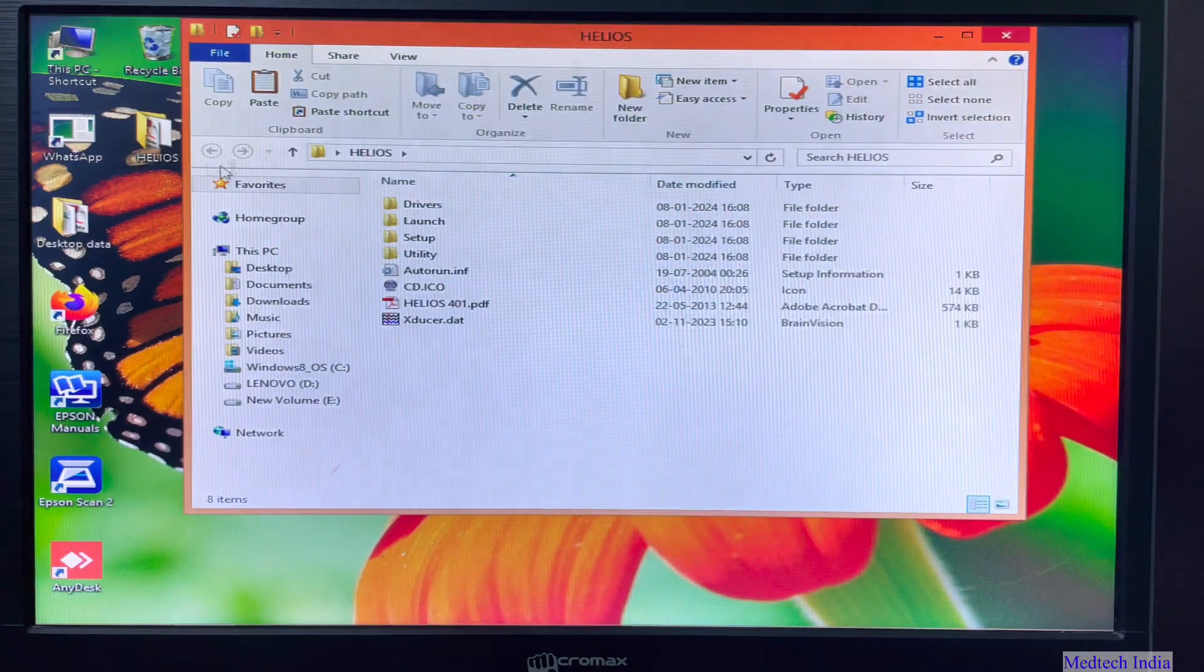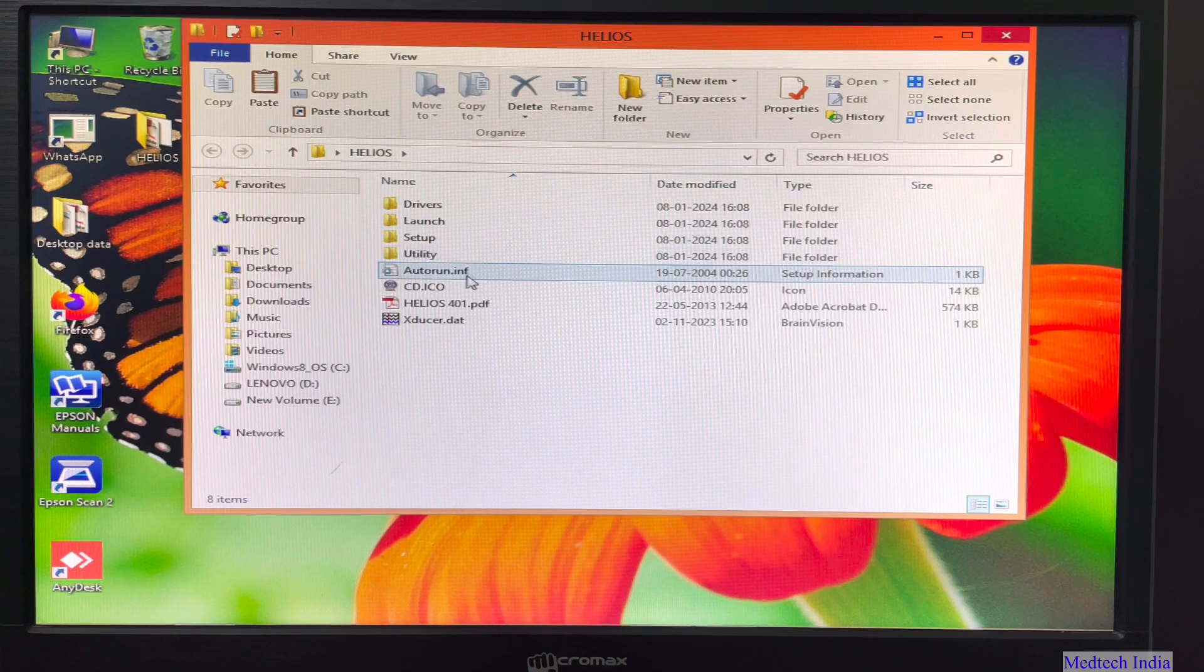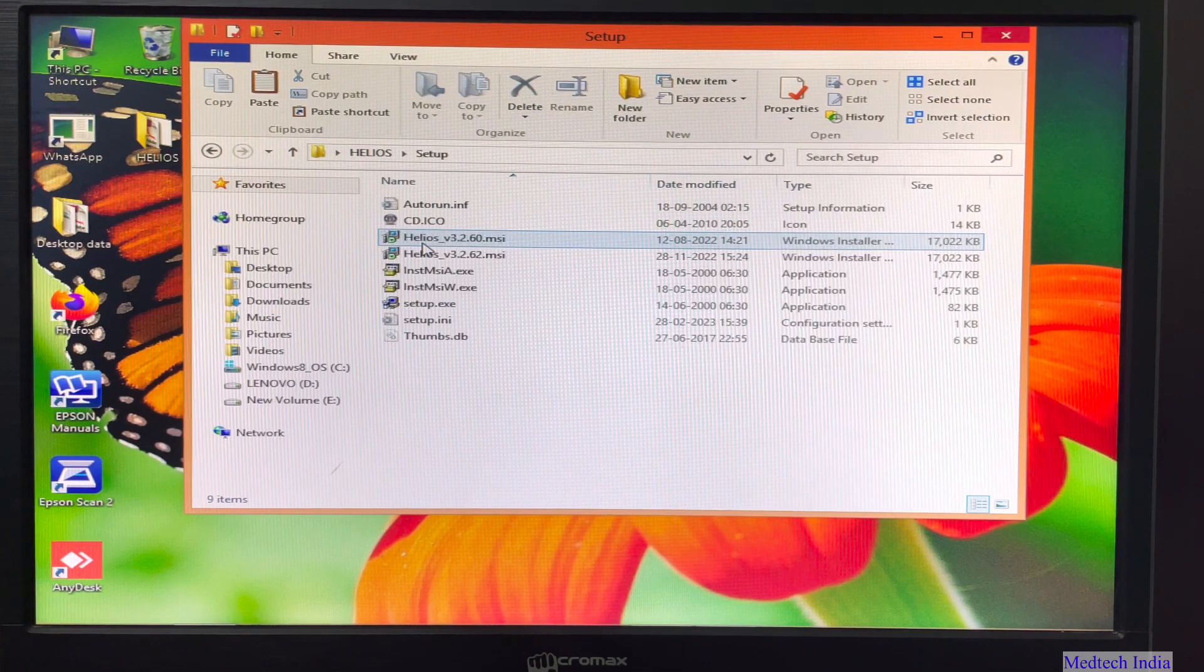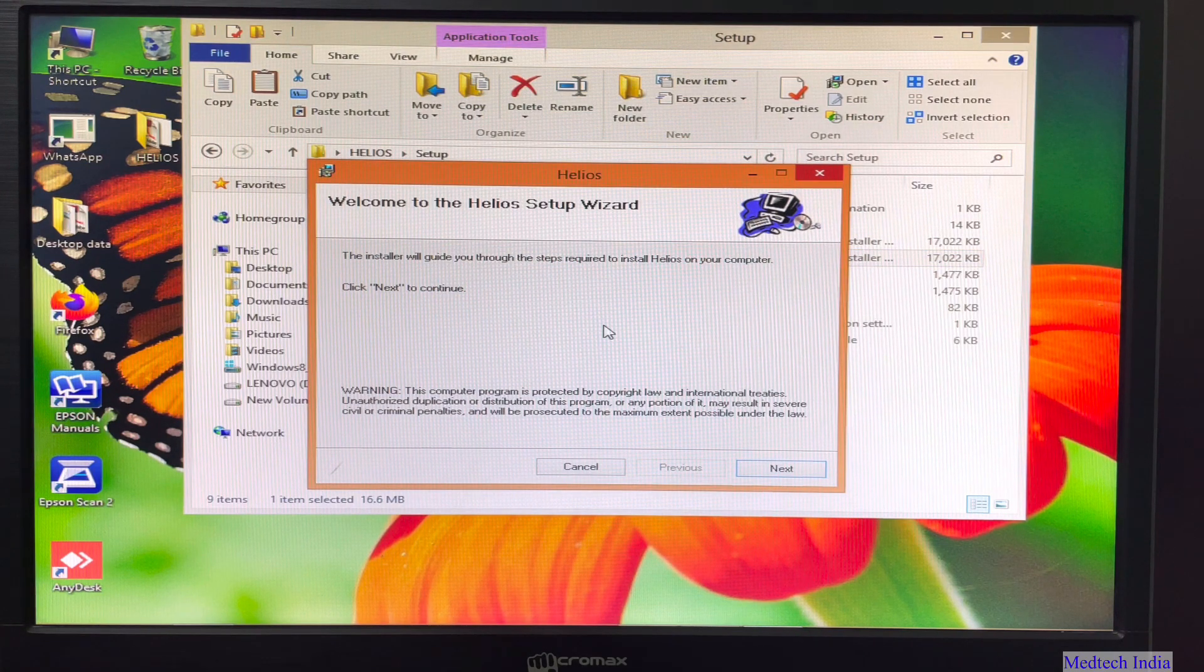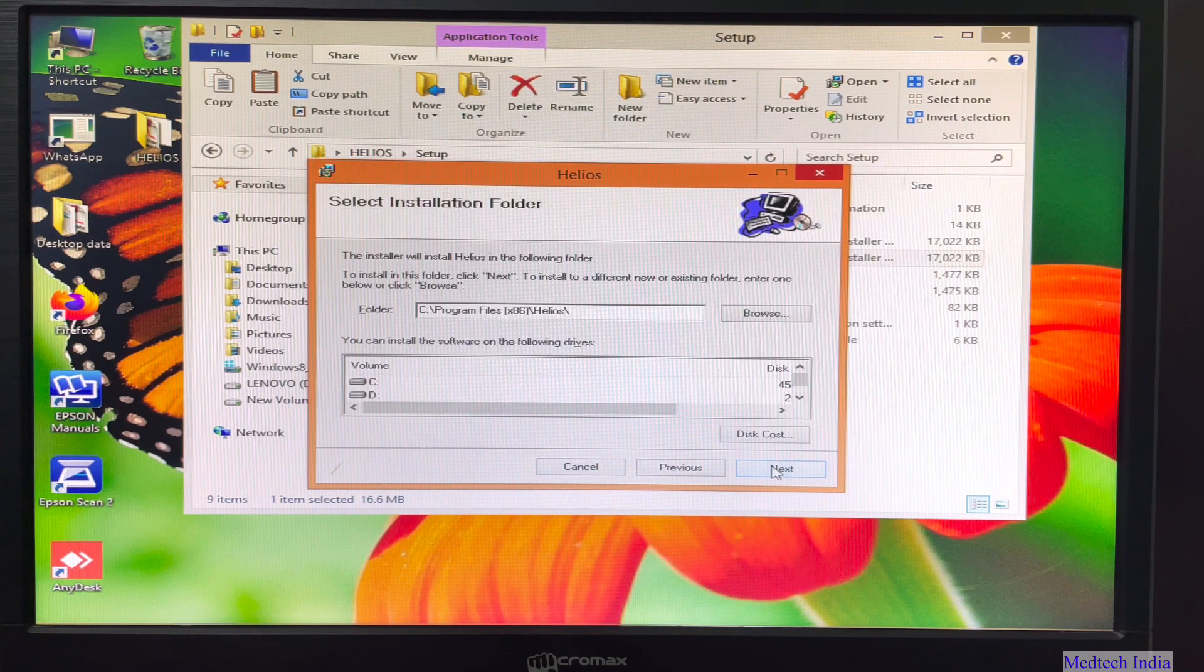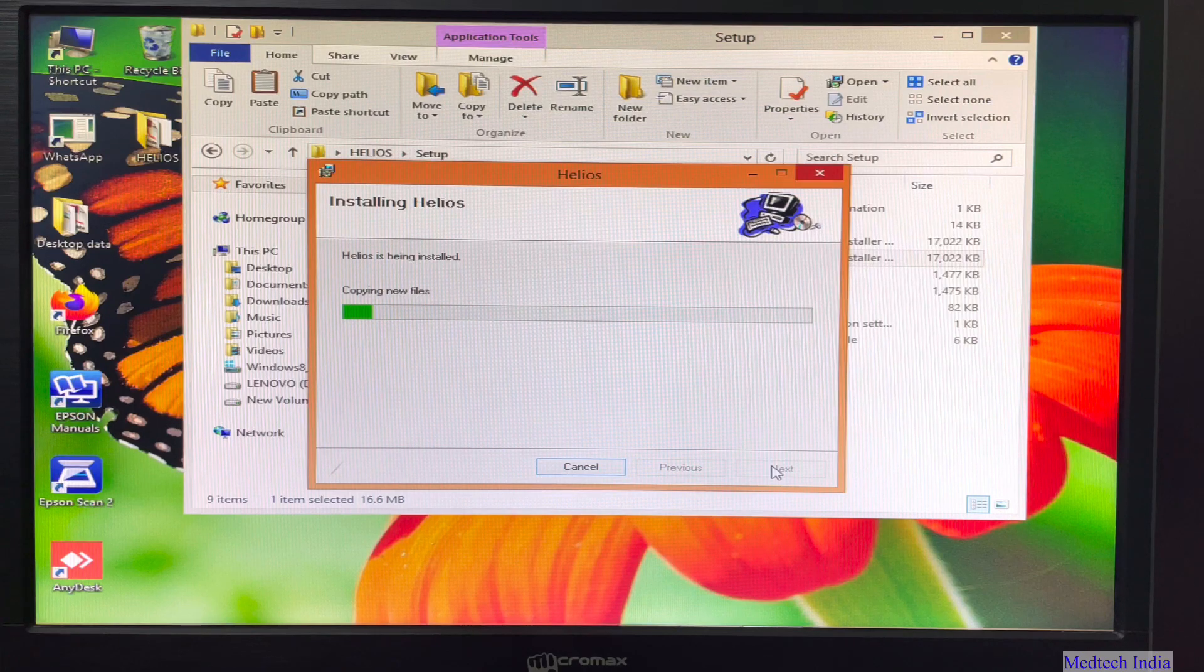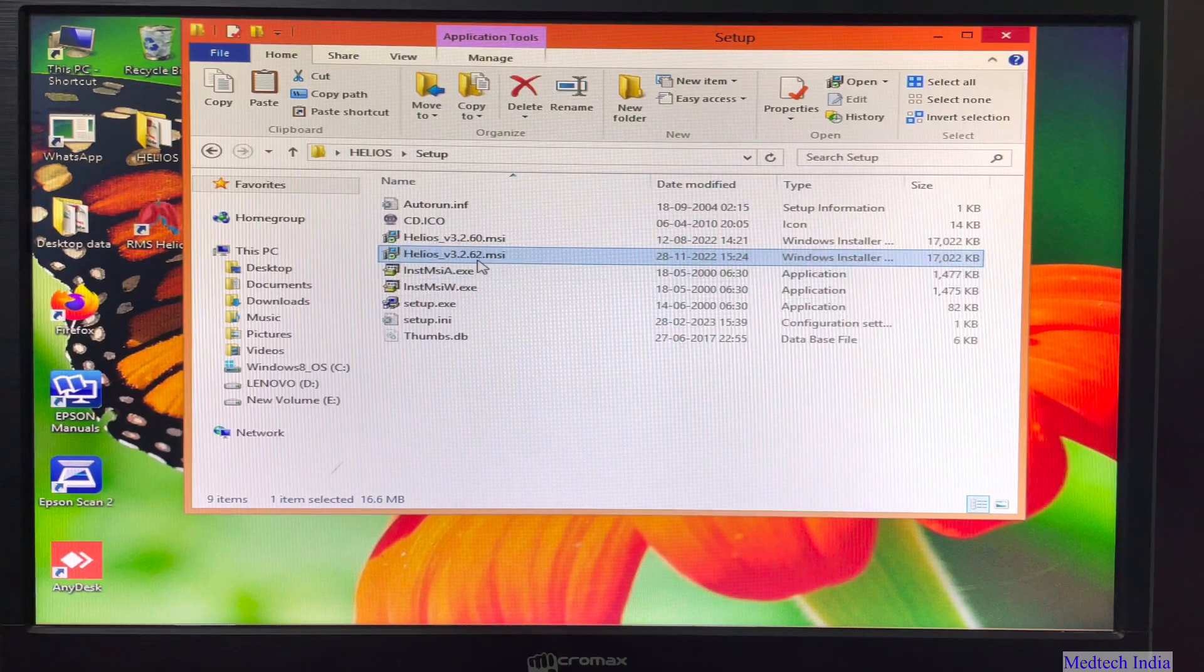So let us double click on Helios folder. So here again we are getting various folders such as drivers, launch, setup, utility. So let us click on setup. After clicking on setup, we will get latest software versions. So I am double clicking on Helios 3.2.62 version. After clicking this small window will pop up. So let us click three times on next, next and next. Then our software will get installed and then click on close. So our software installed now.